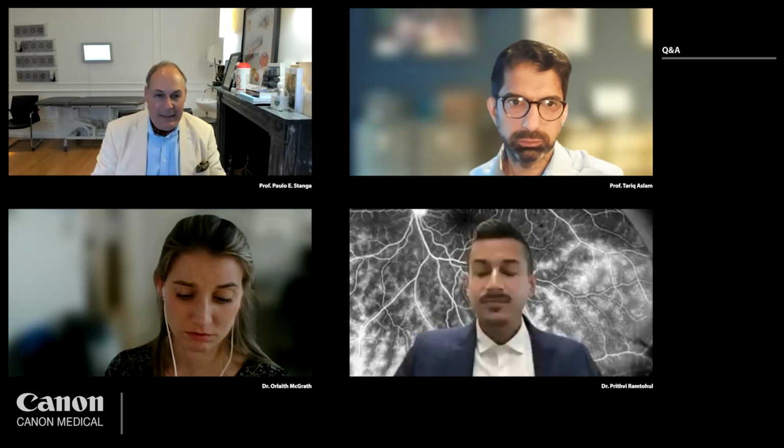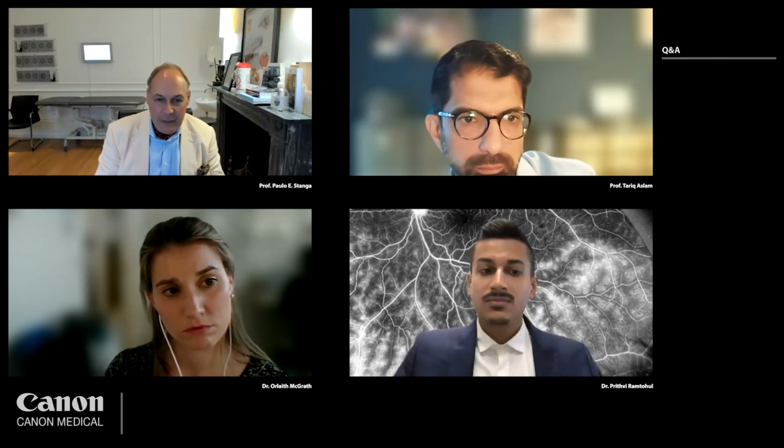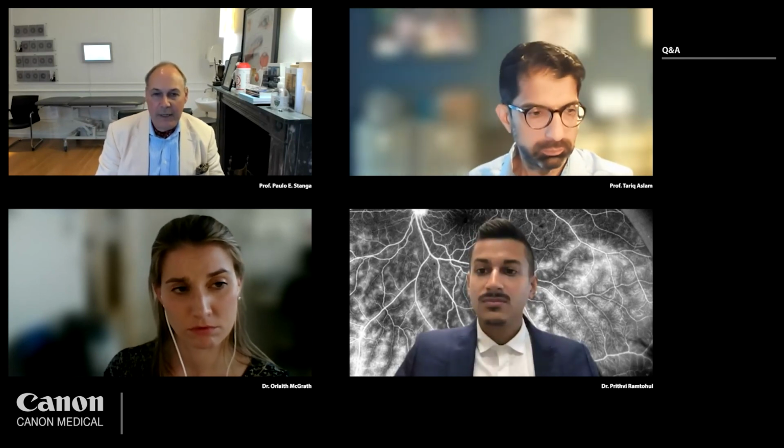examinations. But traction, if you want to document it, you need OCT. Peripheral OCT to document fluid. OCT is very good. Sometimes you have peripheral lesions that you don't know whether they are elevated or not, as I've shown you with the giant vitreoretinal tuft. So I think we need to talk about complementing rather than replacement of technologies. We live in an era of multimodal imaging. So I don't think anybody expects that we are just going to use one technology. So thank you for the questions.